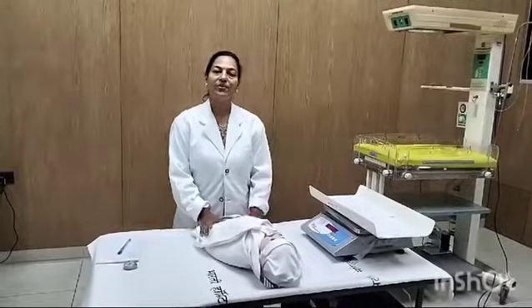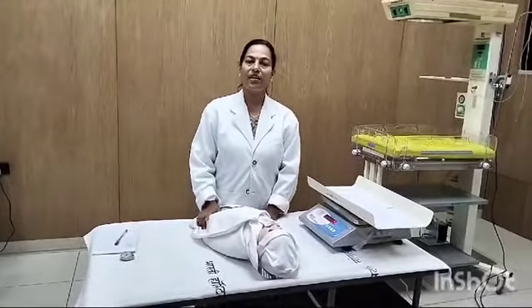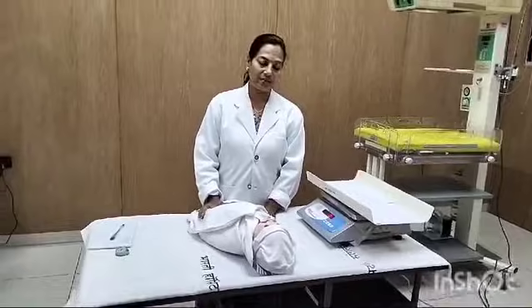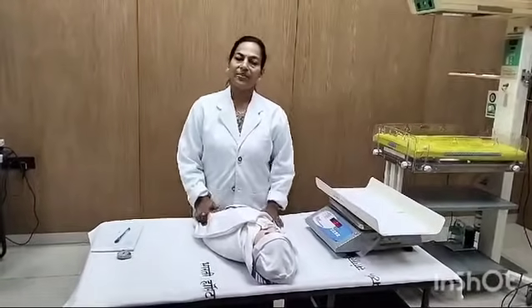Hello everyone, today we are going to see in detail about how to take an anthropometric measurement. So what is anthropometric measurement?